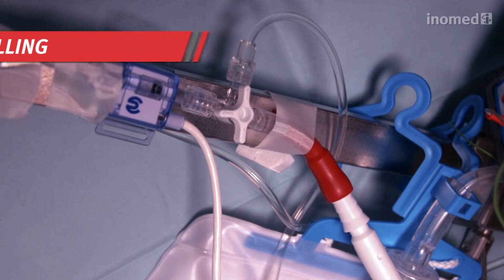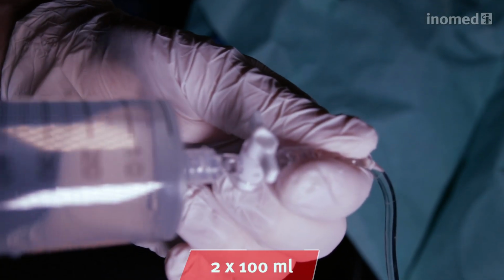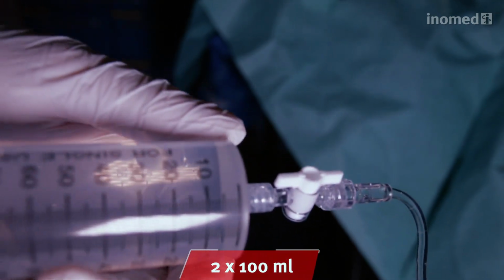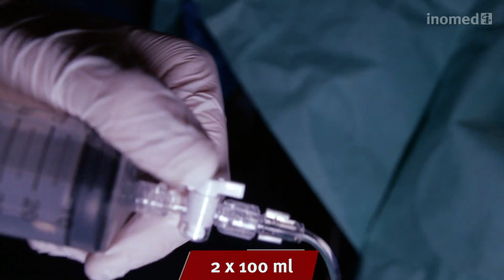The bladder has to be filled in order to monitor its pressure. For this, the 3-way valve has to be turned to block the urine bag. The bladder has to be filled with 200 milliliters of sodium chloride solution.